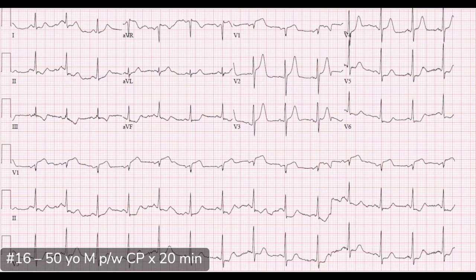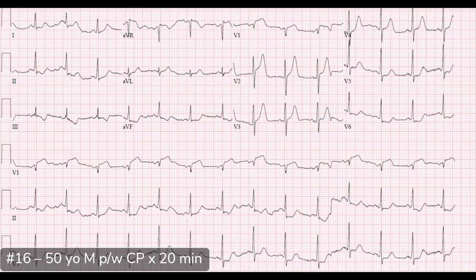Those T waves have a nice clean takeoff from the QRS complex in V2 and V3. They are symmetrical, broad-based, and appear large in size relative to the QRS. Contrast that with hyperkalemic T waves, which we typically classify as more pointy — really uncomfortable to sit on — and they don't necessarily have that size difference from the QRS complex.